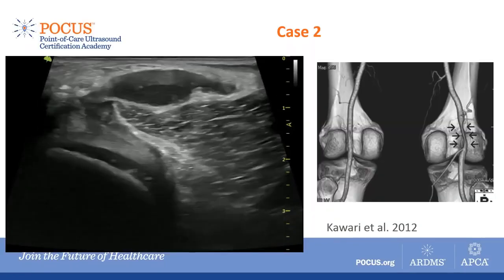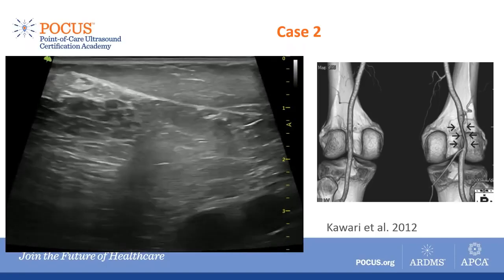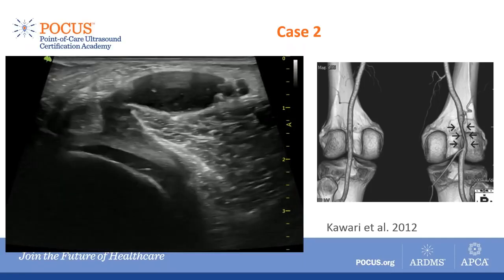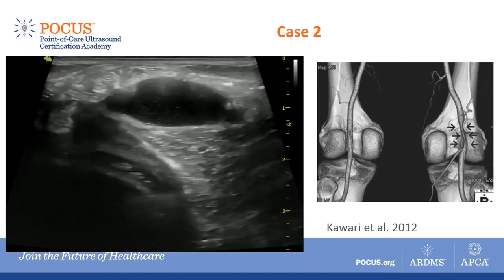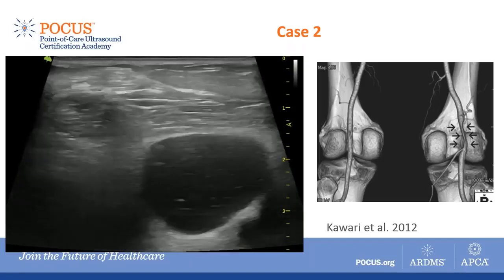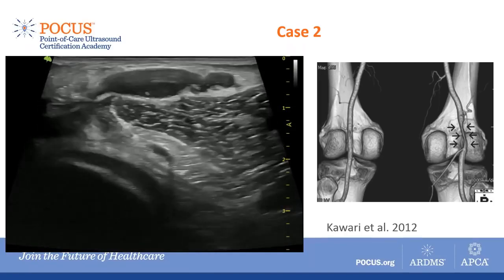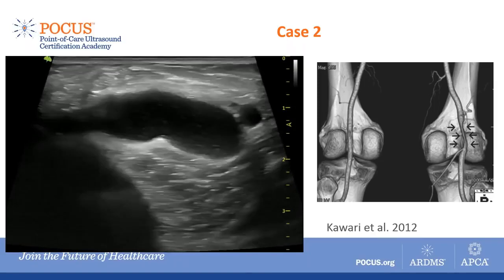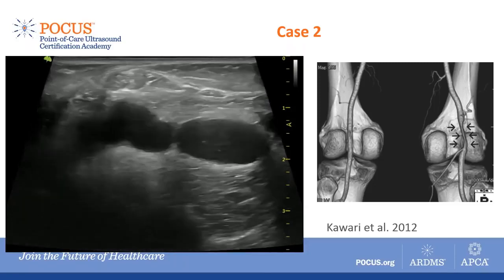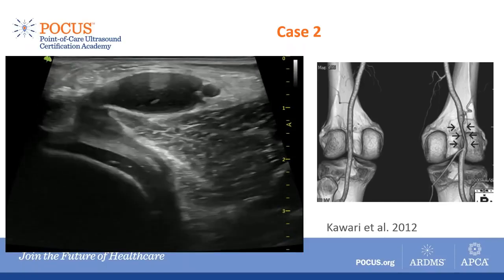This is very interesting. These are images of the knee of one of my students that attended a course the other day. She had some history of knee pain, but she wasn't experiencing any at that moment. While scanning her dorsal knee, we can see a Baker cyst originating from the typical location between the medial gastrocnemius and the semimembranosus tendons. She was not aware of this cyst before we scanned her knee. Usually these cysts tend to stay superficial, just deep to the subcutaneous tissue. But in this case, you see that it travels proximally and deep towards the popliteal artery. As you can see, it is located right next to the artery.